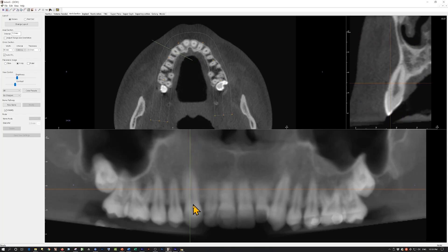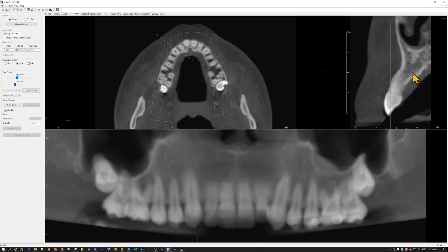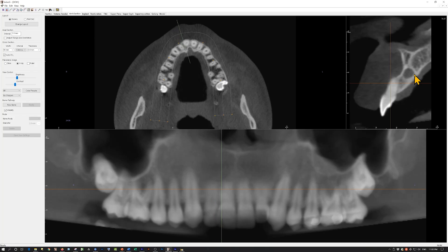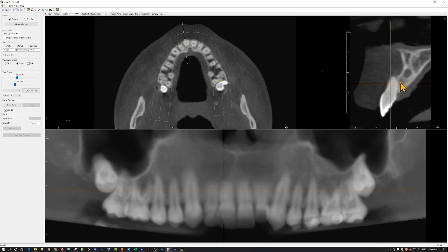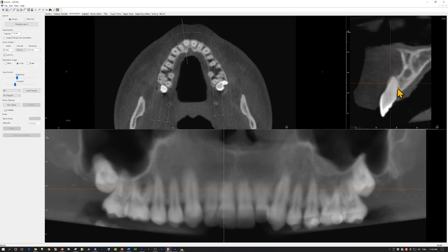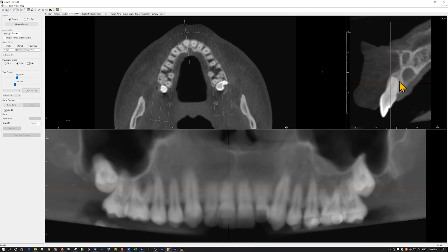This line is going through the right canine and we are seeing the right canine here. As we scroll through the canine we are now in the lateral incisor. As we move mesially to the area of the central incisor, this is the apex of the central incisor and there may be a little bit of widening of the PDL space. The interesting finding is that there is a cystic lesion not associated with the central incisor.